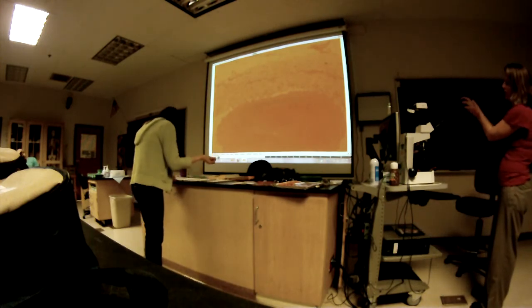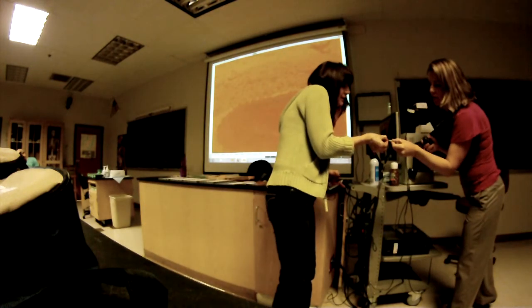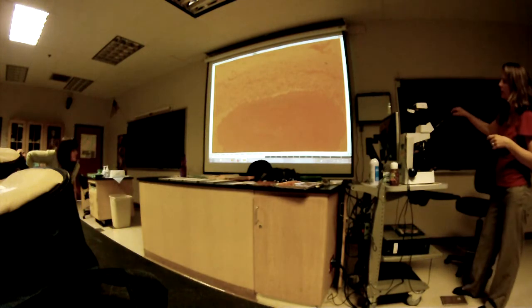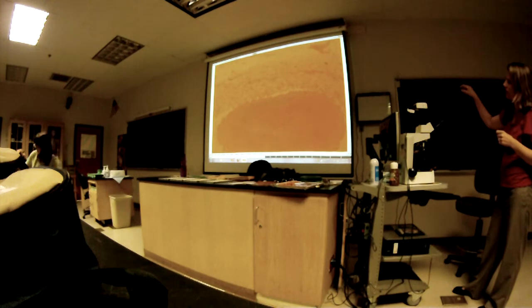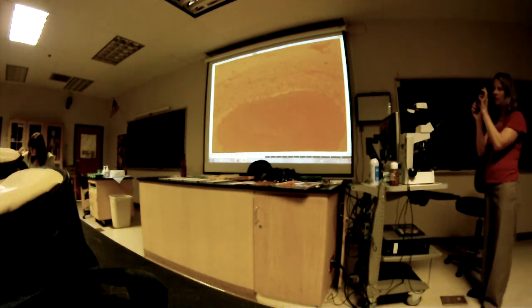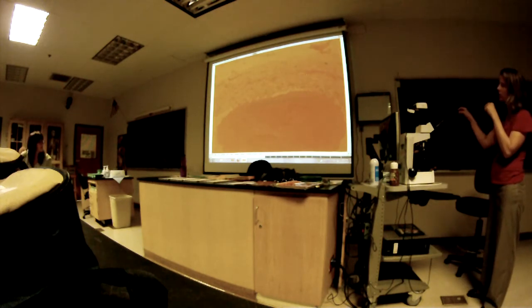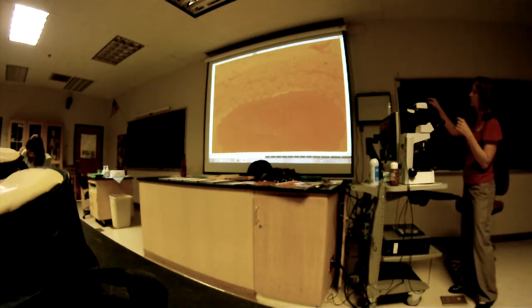F23L, it's the artery and vein. This one just says F23, is that it? Yeah, that's it, thanks. Okay, so this is inside of the artery here, that's blood. And what we're looking at here is the three layers. Okay, the intima is a very thin inside layer. The media is the thicker, smooth muscle layer, and the adventitia is the outer collagen, dense fibrous tissue layer.